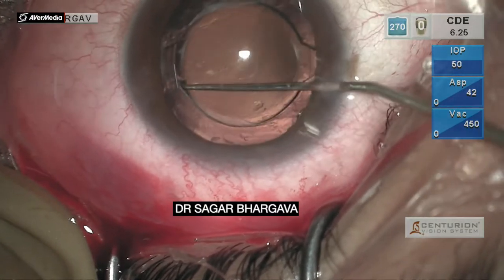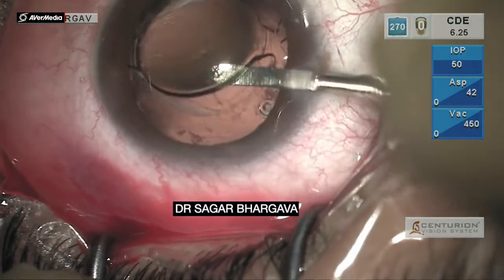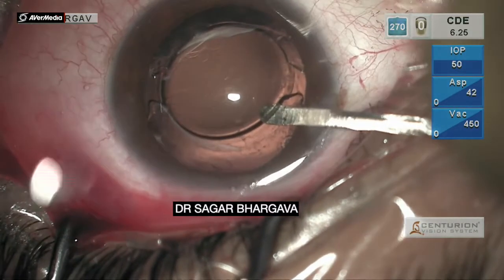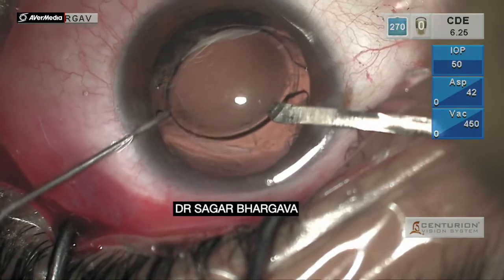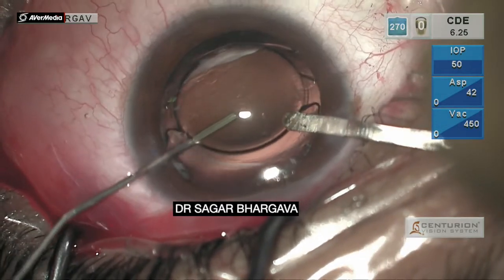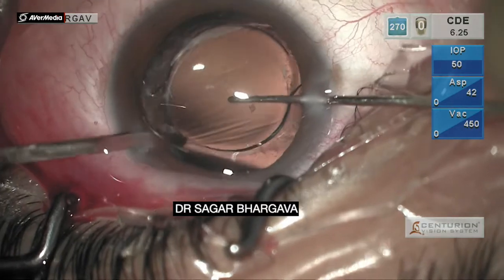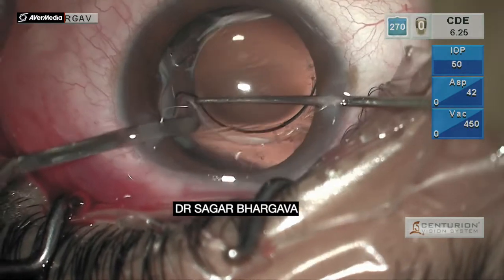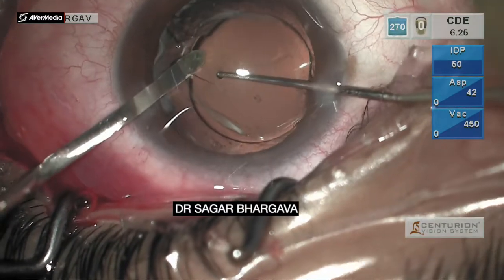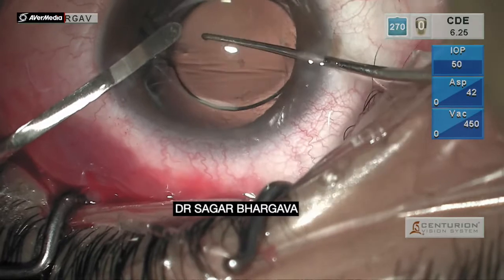Subsequently, it was decided to push a little viscoelastic behind the lens optic, as you can see here, by lifting the optic with the help of a spatula. With this, it was possible to give a little back support to the IOL. With the other hand, a dialer is used to gradually dislodge the IOL haptic.